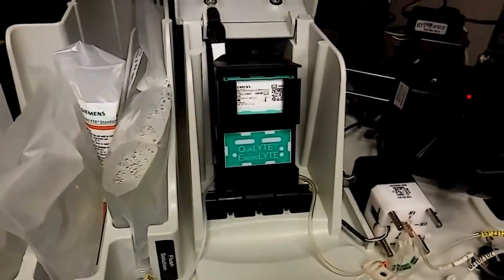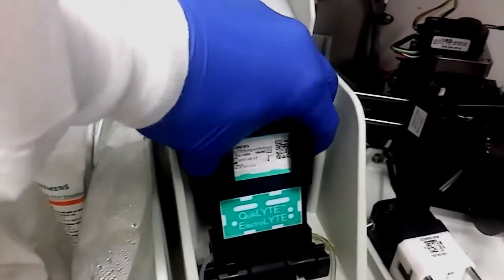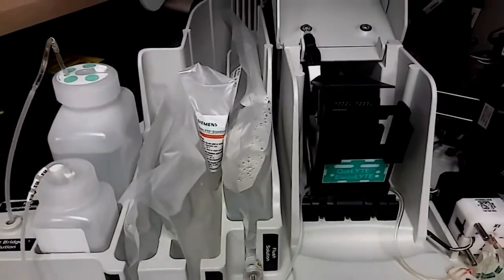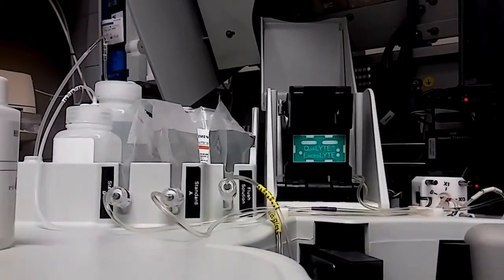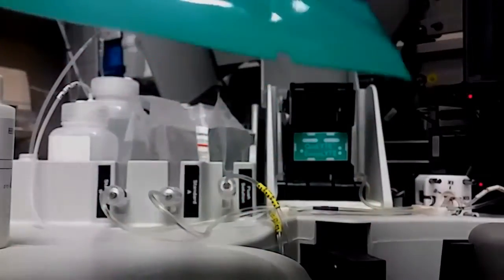So we'll go back to here. You want to push this back button and it'll kind of pop out. Then you want to take the sensor out like this. Now you don't really want to touch any part of the sensor, especially the back part where the little prongs are, since that's what reads the electrolytes. So be careful.